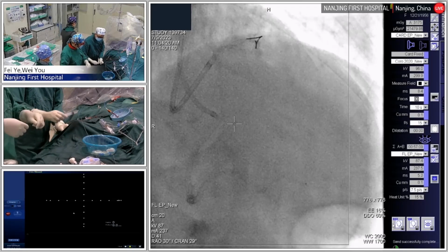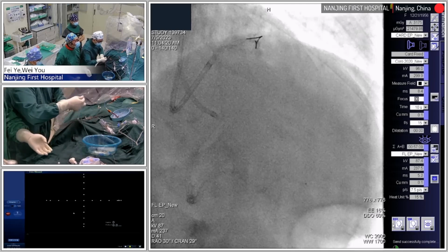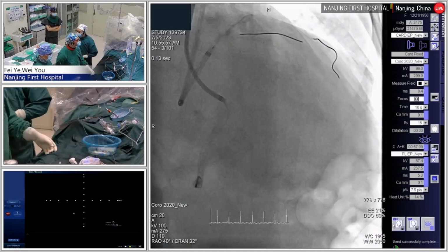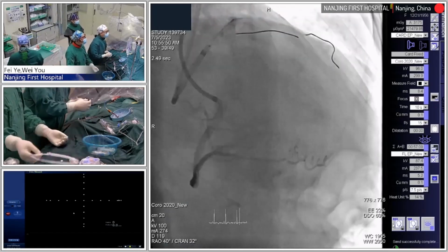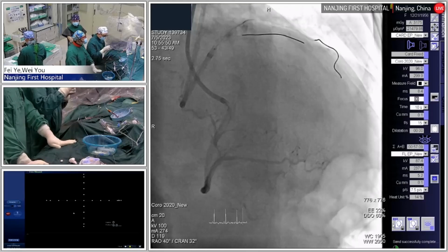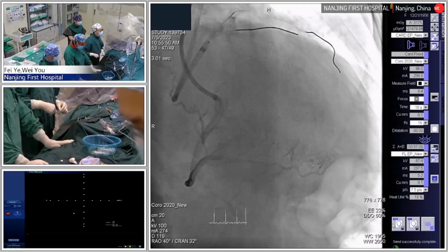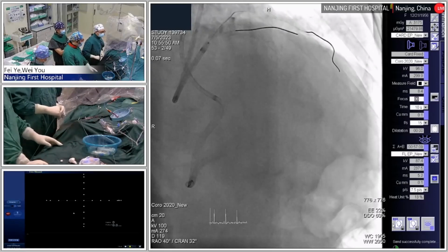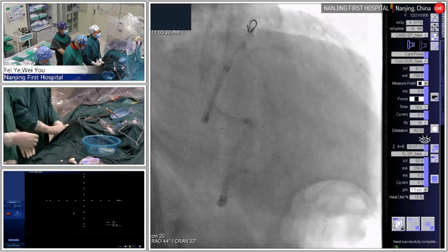Withdraw the wire. Be careful. Give me a new CR. This is the extension wire. CR, please. Here, no, here. The tip maybe use the distal one, right? Distal. The angulation and the ostium of the septal was not very clear from the angle. It's a little difficult. Maybe tip injection doesn't work, so just use the surfing. You will find the septal first, then use the surfing, if you cannot find the same position.